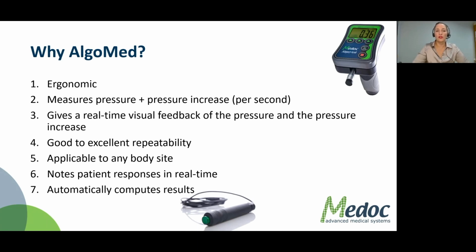And last but not least, it computes the results automatically. I'll show you later on the screen, those results are automatically computed and averaged, and you have standard deviations for those, so you have a good statistical measure of how well you did the test and how reliable these results are.